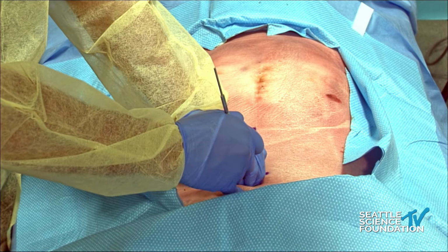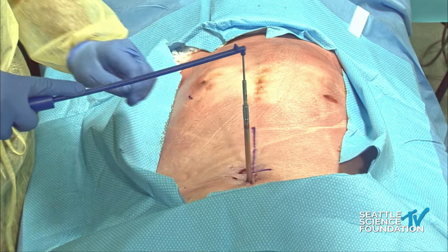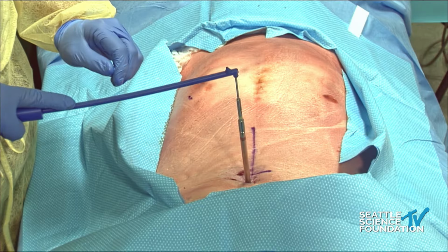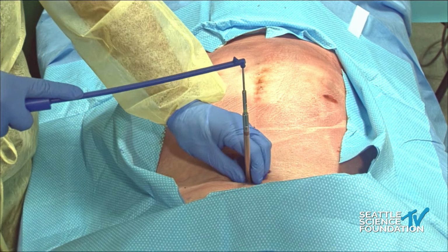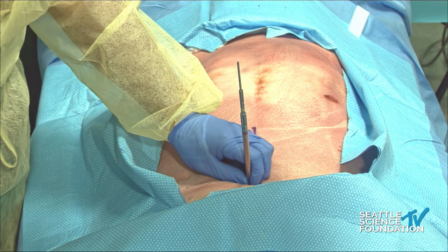Okay, and then let me get this guy here, and take a shot there. So you can see, angle again, shot there. That's my starting point, right? So when I put my endoscope in, the first thing I'm gonna see is that bony ledge. And let's just, for the sake, we don't have the endoscope set up right now, or we do?